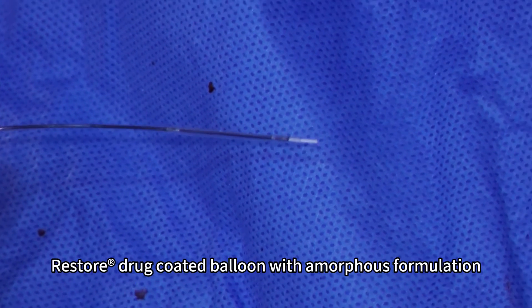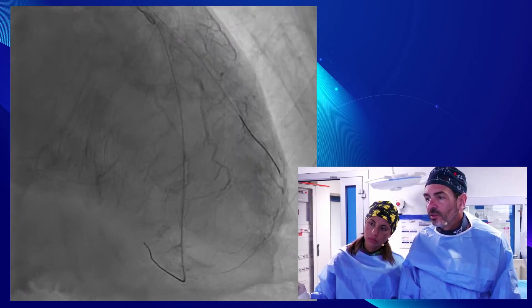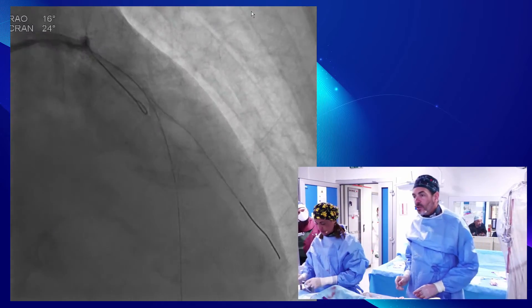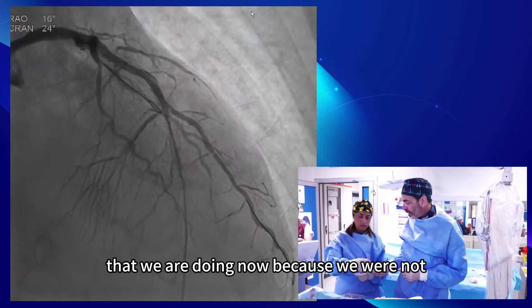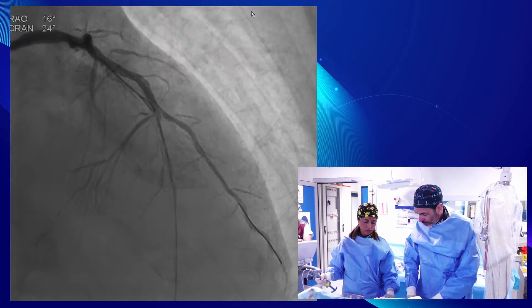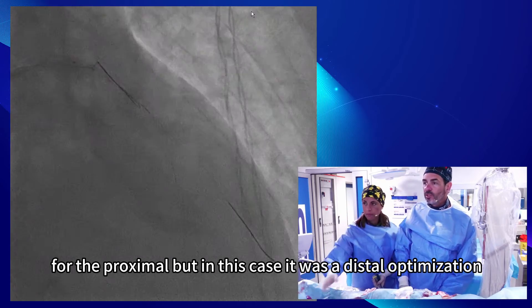This is the Restore drug-coated balloon with an amorphous formulation — you can see there is no flake of paclitaxel on it, so there is no risk of distal embolization as you may have with a crystalline formulation. We have now delivered the drug with three drug-coated paclitaxel balloons. We are waiting a few minutes while we finalize optimization of the stent distally using another POT non-compliant balloon, a 3.5 POT, for distal optimization.